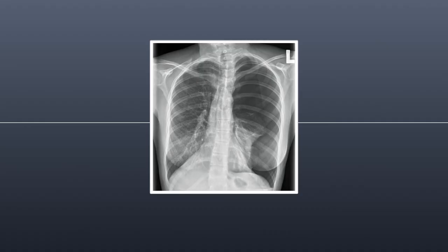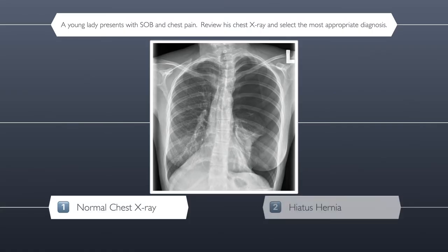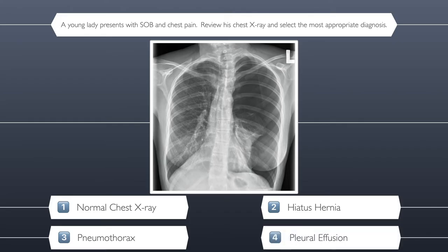Question three. A young lady presents with shortness of breath and chest pain. Please review the chest x-ray and select the most appropriate diagnosis. Here are your four possible answers: is it a normal chest x-ray, hiatus hernia, pneumothorax, or pleural effusion? The correct answer is pneumothorax.